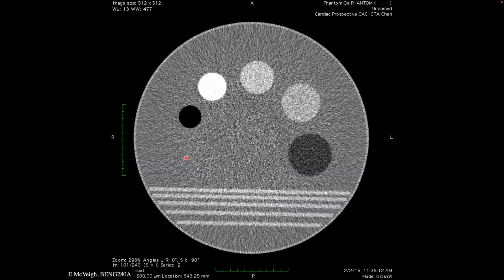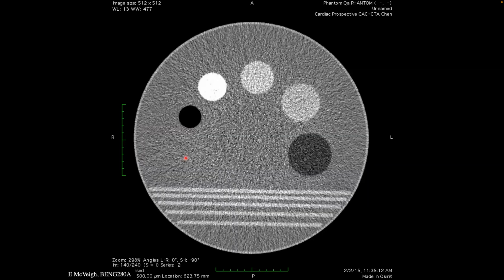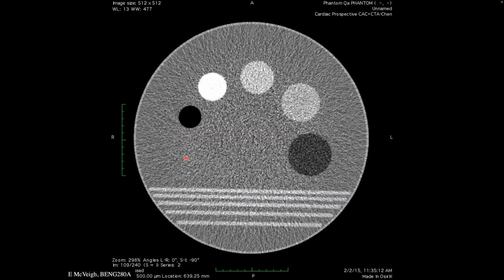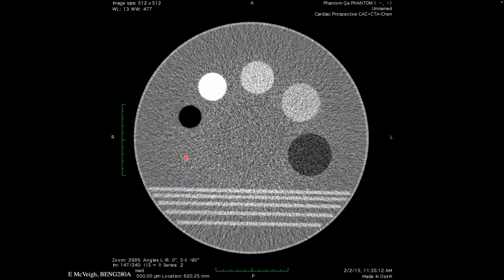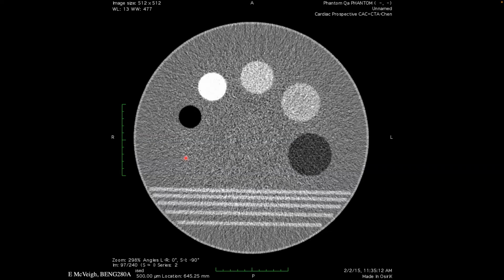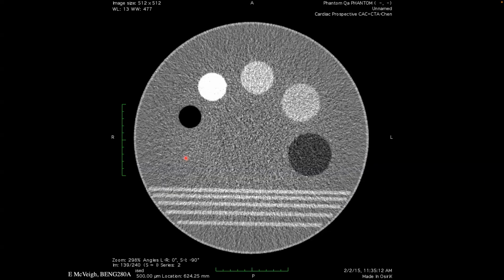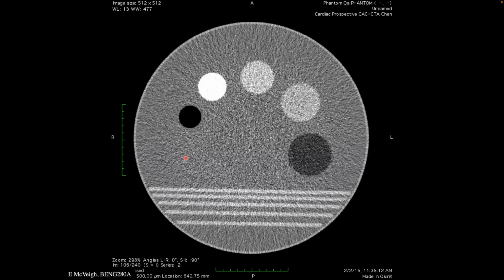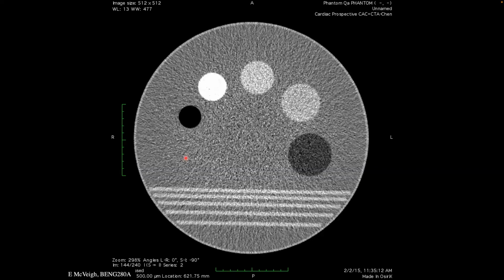But normally what they do is they scan through the data and say, this detector is obviously bad, so we're going to drop it and interpolate its value. But it's a complicated business. It's not just a simple mean field with white noise on top.